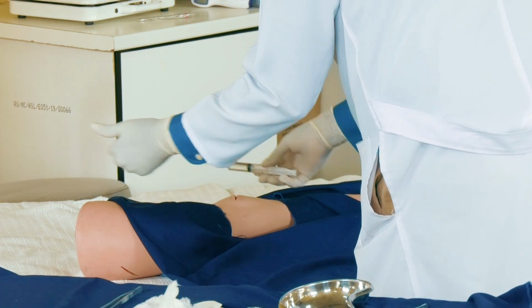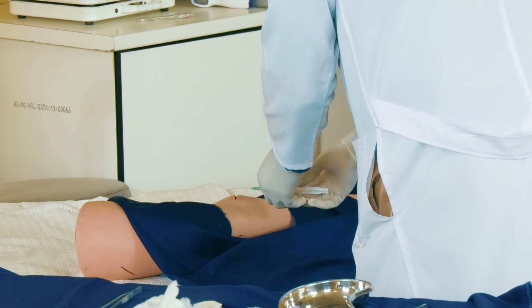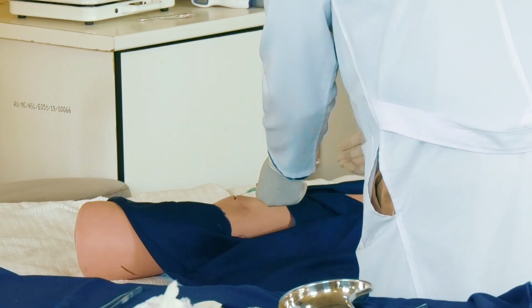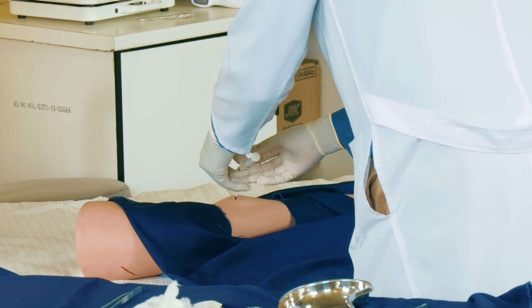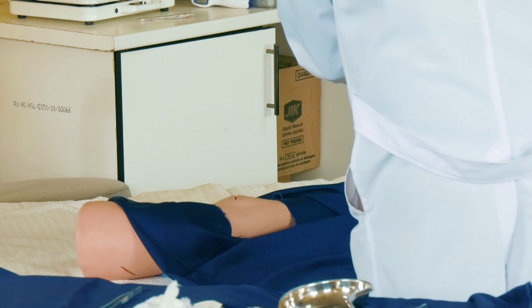I'll inject, tell the patient it will pain a bit, but later on it will be numb so that when I'm suturing, it is not going to be painful. So that's what happens. You push in, withdraw. I'm not in a blood vessel, push in the drug. Go on the other side, just like that. So don't start jumping because the patient has this wound. The wound is actually more painful than the needle that you are pushing in.